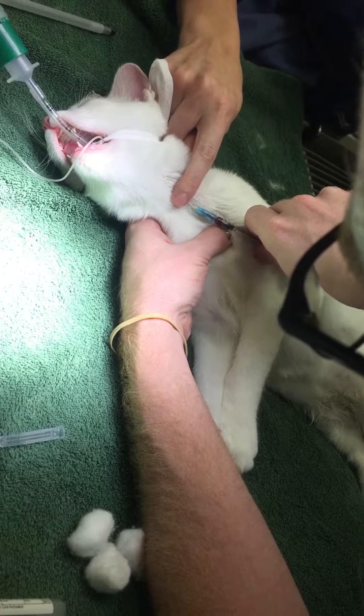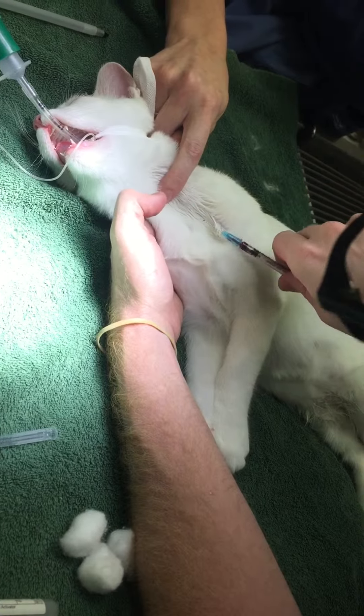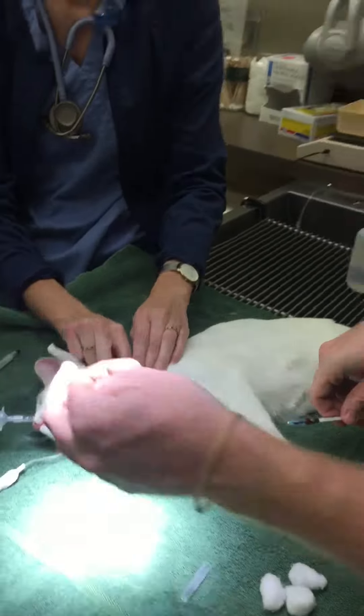I do have blood. I'll go ahead and let it off, and I'll take my needle out, and we're going to cover that spot for at least 60 seconds so a hematoma doesn't form.